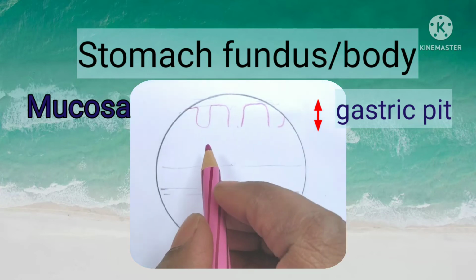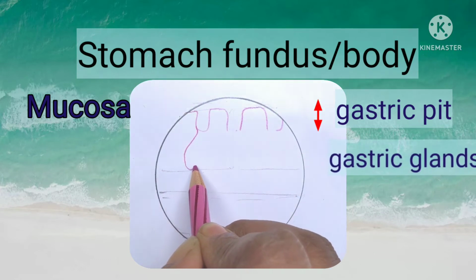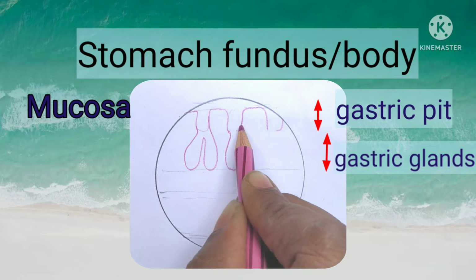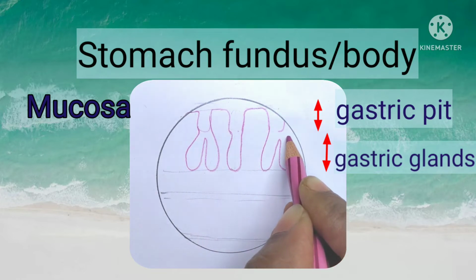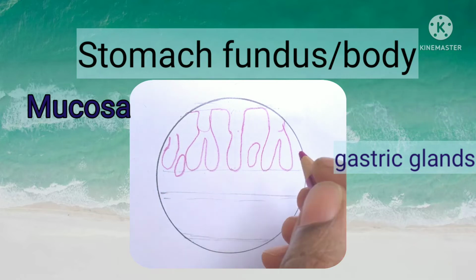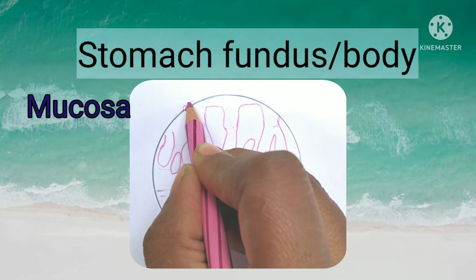So the stomach, as usual, we will go to the first layer, the mucosa, which consists of the epithelium. The epithelium has pits. Pits are nothing but depressions which you can grossly also see with the lens. So the base of the pit consists of glands, gastric glands. These are straight tubular glands. They are branched. They extend from the bottom of the pit till the muscularis mucosae.